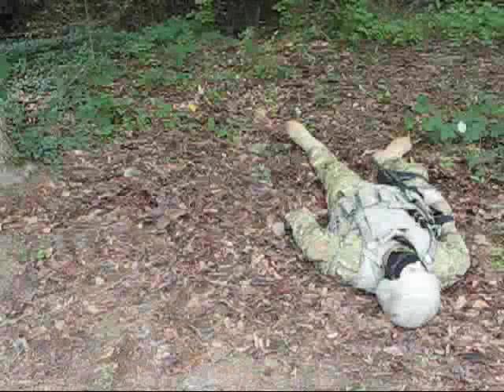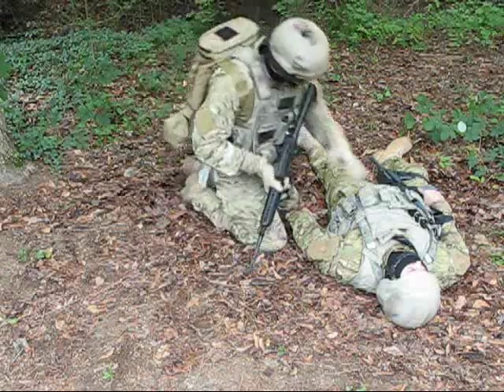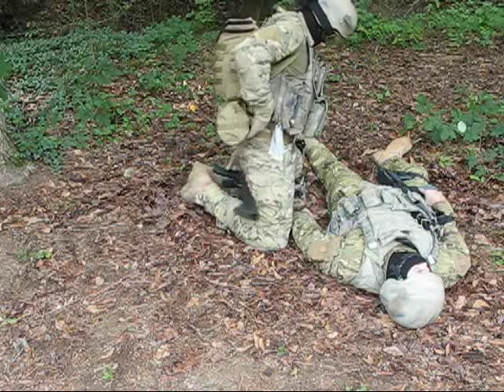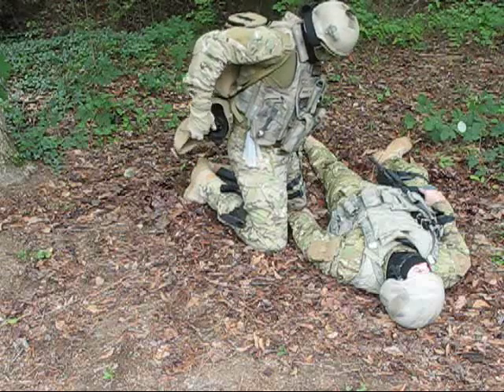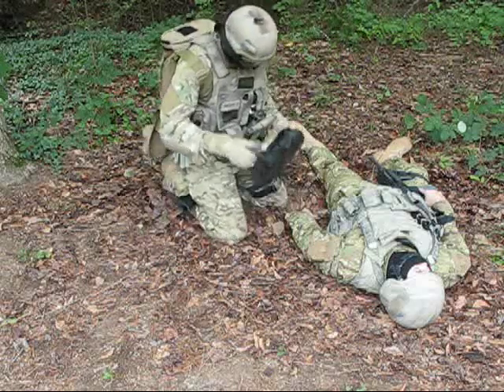Removing the litter from the carrier. The Foxtrot litter is stored rolled in its carrier. To remove the litter, grasp the carrier with one hand and the litter with the other and pull. It will then slide free of the carrier.